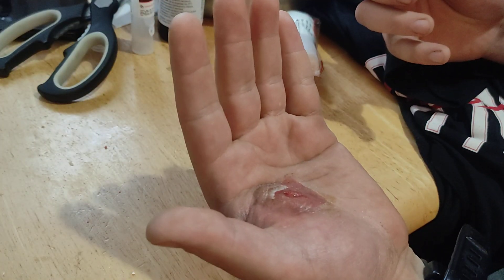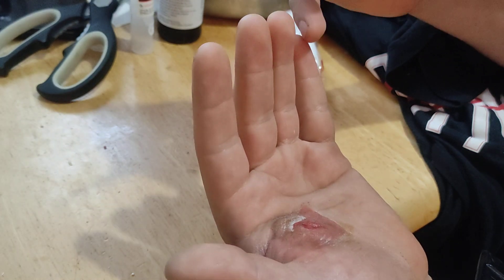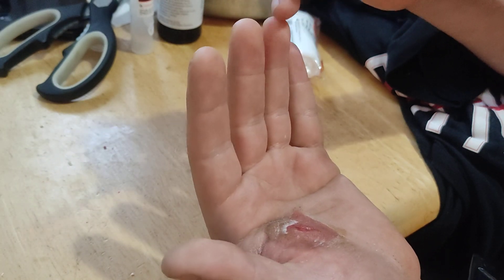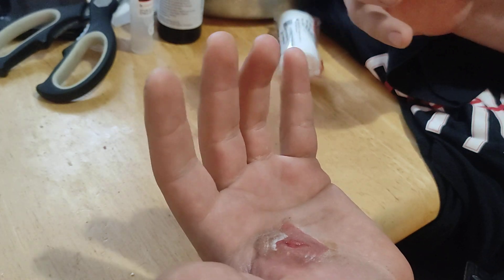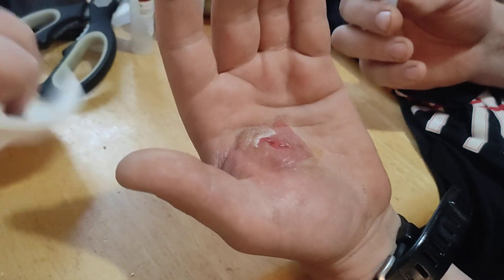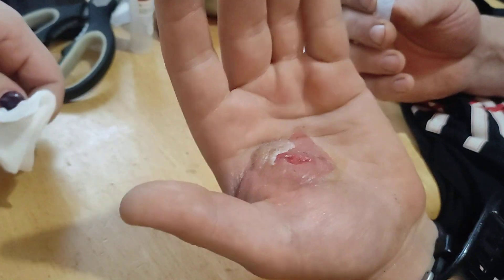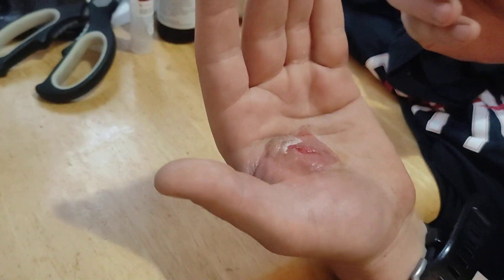While we're waiting, I wanted to add something. I have some sensation in all of my fingers, so I can feel hot, cold, and touch on all sides. If you have anything that you don't feel around your fingers and you can't move them, you need to go to the ER. Not that they can do something about it, but still. So keep that in mind. I think it's a little bit over 60 seconds and it's still a little bit shiny, but there is no blood coming out, so I'll put another layer.